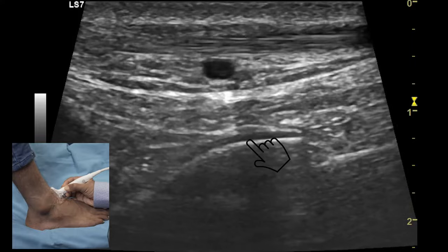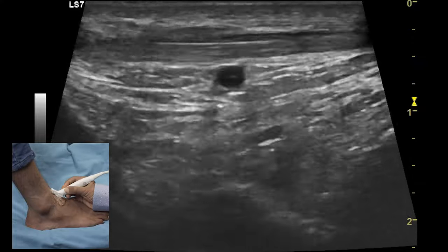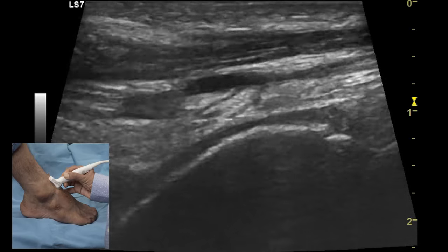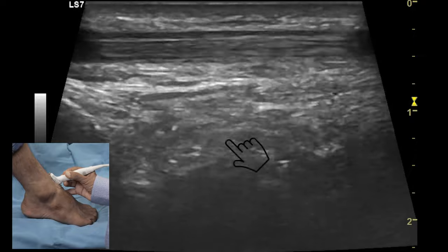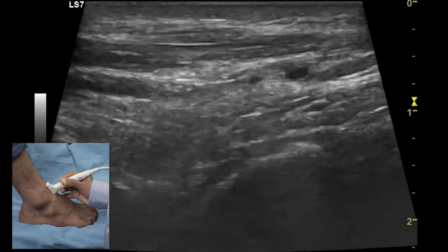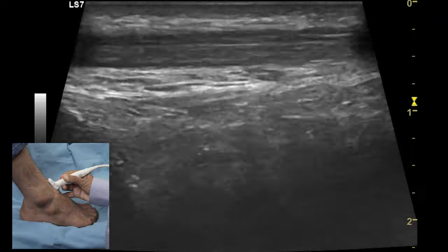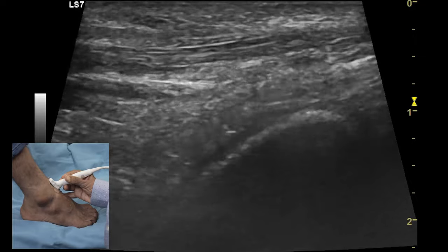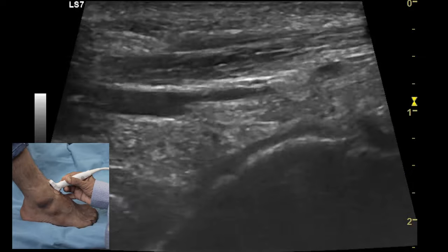By moving the transducer from the medial to lateral aspect, the entire extent of the joint space is evaluated for any evidence of synovitis or synovial hypertrophy. By asking the patient to do a plantar flexion, an additional component of the cartilage covering the talar dome can be visualized. By extending your probe from medial to lateral side, almost 80% of the cartilage covering the talar dome can be visualized. However, one point of caution: ultrasound is not the best examination to evaluate osteochondral injury — MRI is the modality of choice.